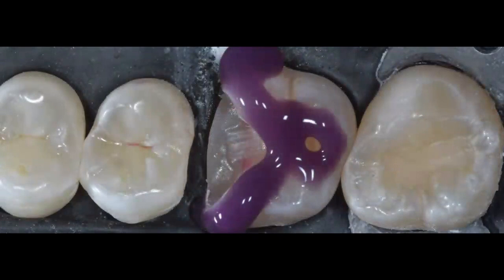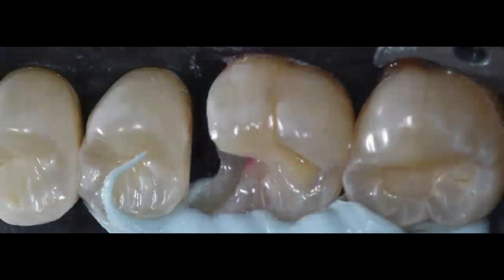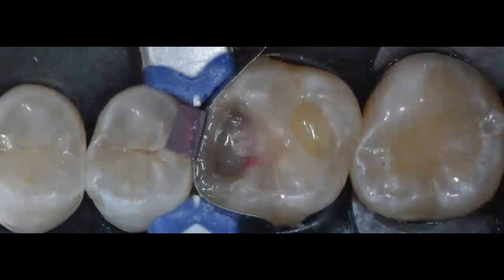I'm going to go ahead and do what we call reverse selective etching of the enamel. I'm going to rinse, I'm going to dry, and I'm going to now place my new band. I'm going to build my proximal walls, the buccal and the lingual, so that now, after building those proximal walls using that personalized matrix band, I'm able to place my sectional matrix, use my Garrison short ring that is going to again recreate that added separation, or create some pressure in between 3 and 4, so that it separates slightly these teeth, and that allows me to accomplish a really nice and tight contact.